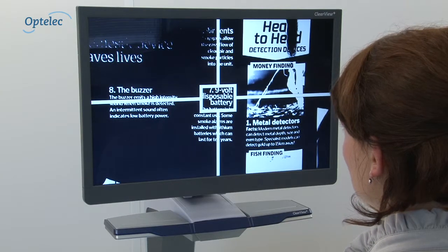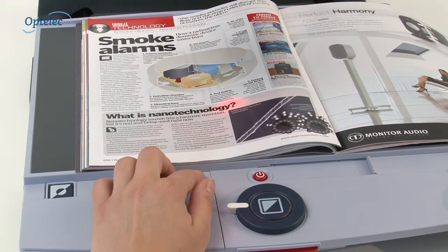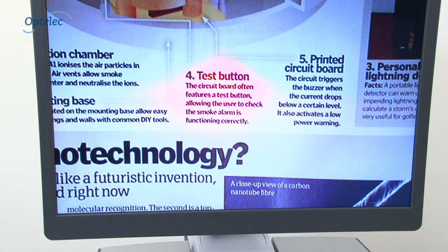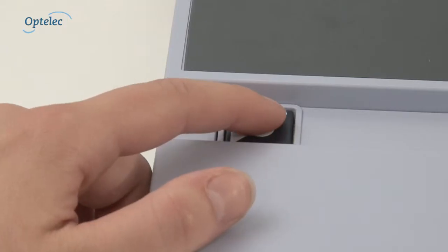When pressing the pointer button for more than three seconds, you will activate the red light position locator, indicating on the reading table what is displayed in the middle of the screen.